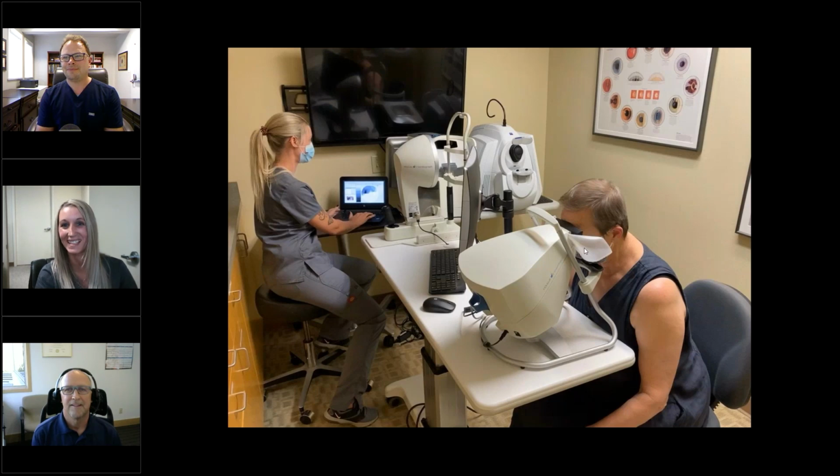Yeah, I can, because I love the Smartfield when it comes to ptosis. With the Humphrey, as you know, you're missing a lot of the lights with the eyelid drooping. I did do a study on that, and even with the eyelid not taped, it takes about 10 minutes. Wow. And that's a long time because they're missing all those lights, and you're just sitting there going, oh, come on. And they're probably thinking the same thing. And then you're taping the eyelid, so you're doing the test 2 times per eye.